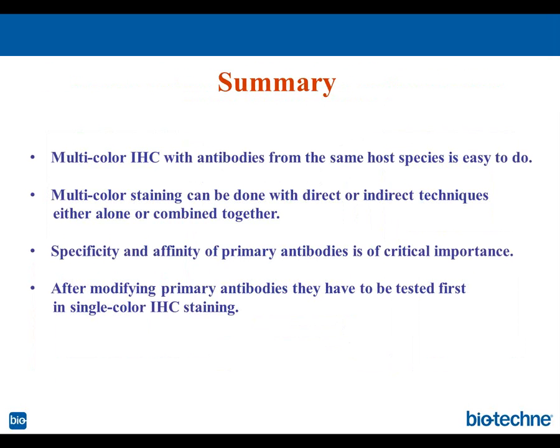But what's important here is to see which retrieval technique should be done first or gives better results. You go with a high pH one, or you go with a low pH one. Easy to do, easy to try on the bench. But before diving into multicolor staining, of course we have to do single color detection to make sure that antibodies are detecting these antigens on the tissues, how we process them.